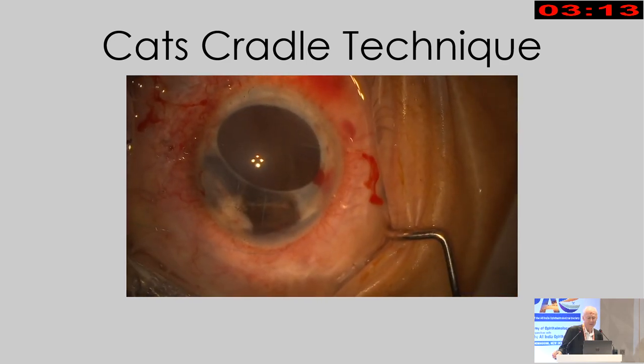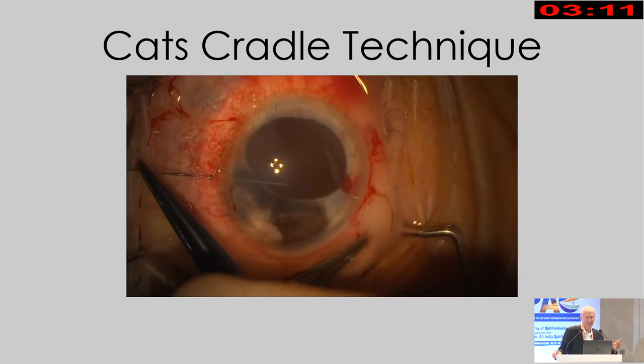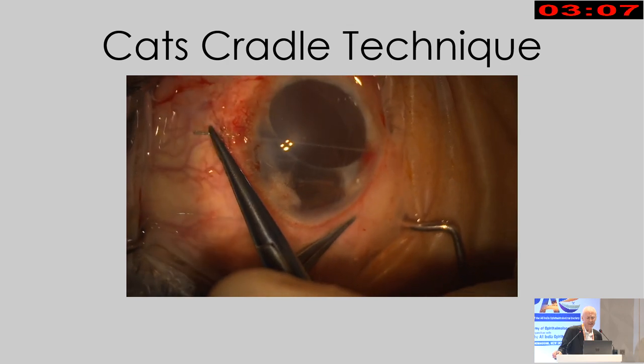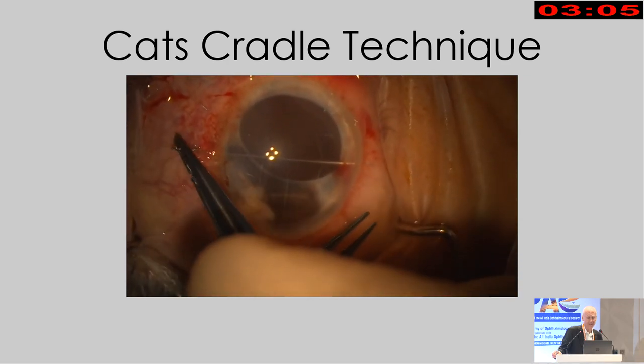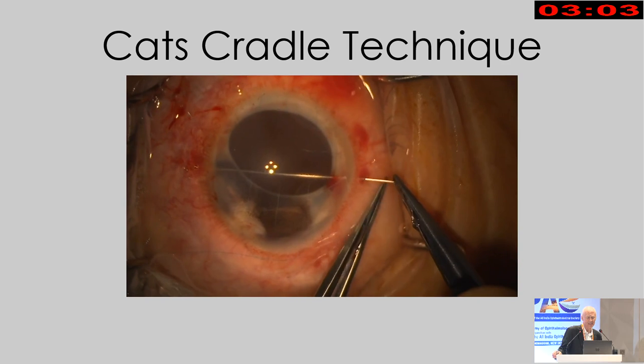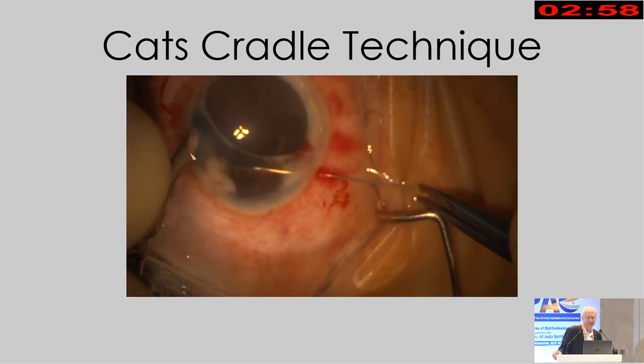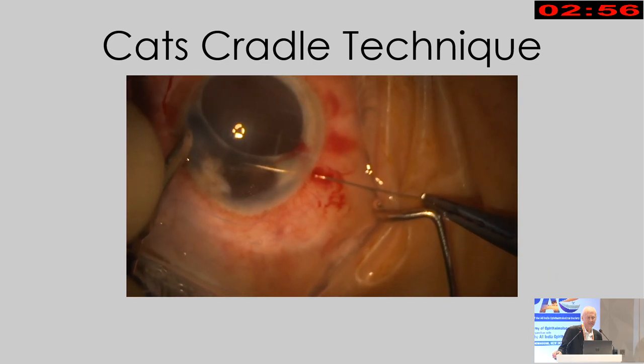A nice variation, if you get a deeper set eye, is to bend the needle. And that was something that was described by Samuel Maskett when he talked about using a similar technique to support intraocular lenses during surgery. And so we should finish up with this last pass, which you're going to see at the moment, just where we started, ready to tie it off. And then you have your safety net, and you're ready to make your incisions.